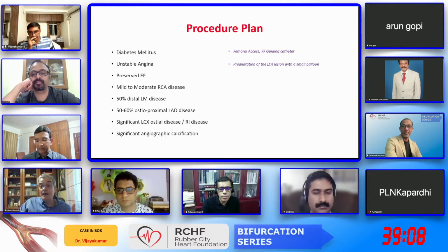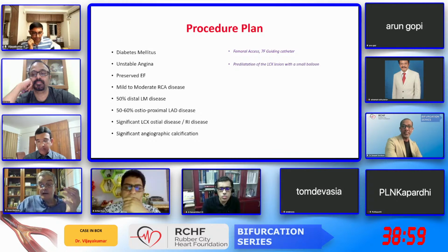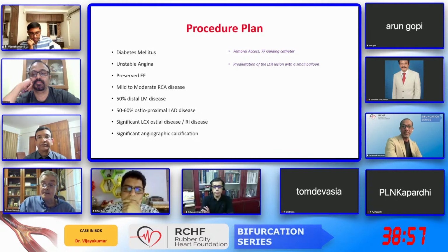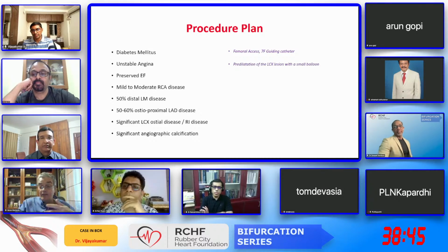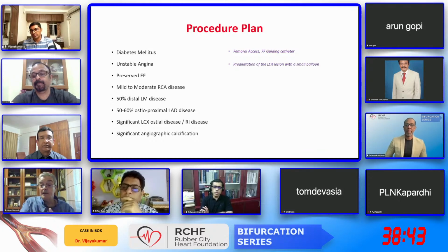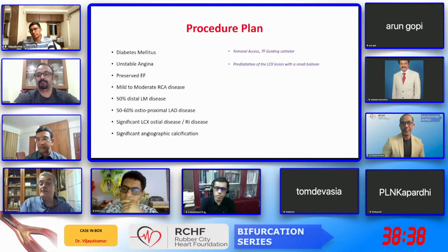According to EBC Main, approximately 22% need two stents, but it depends on the patient and lesion subset. This kind of patient was not tested in EBC Main nor in DK Crush 5. These are the patients that we need to individually discuss all the options, and then we follow the operator giving our comments. But I'm sure at the end we will have an optimal result, and let's go through the steps so we can give comments throughout the procedure.